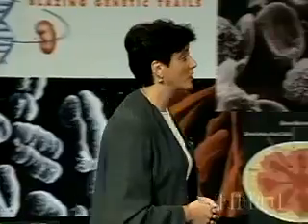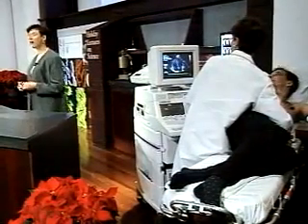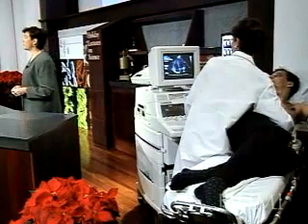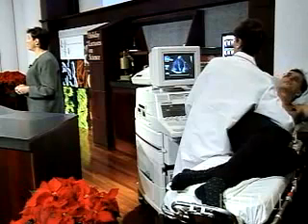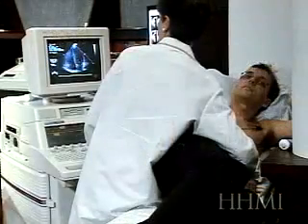I thought it would be fun to see how all of this works in a living subject, and to that end, we're now going to turn our attention over here to an echocardiogram. This is a non-invasive way in which we can ascertain heart structure and function in the living human being. It has the benefit of allowing us to use sound waves rather than any radiation to image the heart, to have an estimate of sizes of the walls of the chamber of the heart and movement of the heart valves.